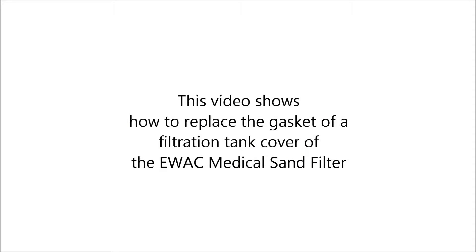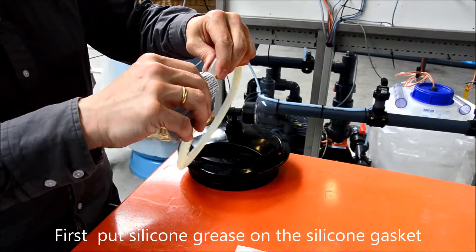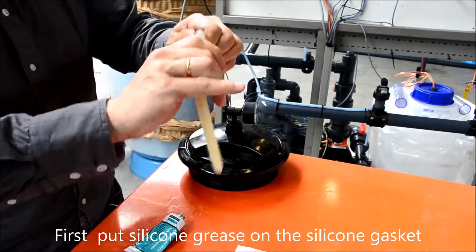This video will show how to replace the gasket of a filtration tank cover of an EWAC medical sand filter. First put silicone grease on the silicone o-ring. Make sure the o-ring is fully covered with silicone grease.